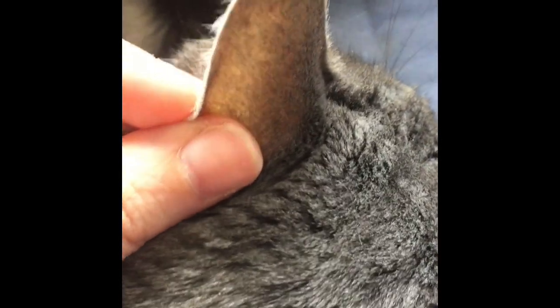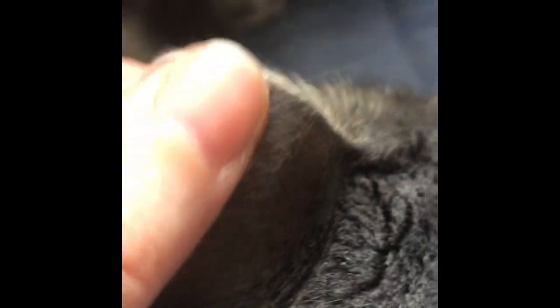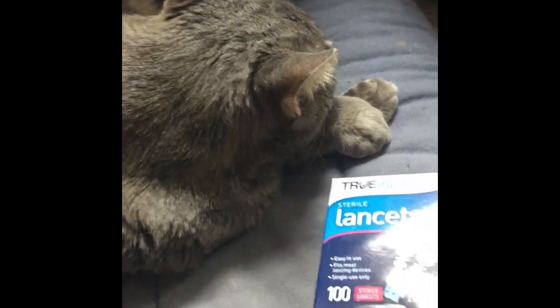So if I kind of hold it up to the light, you can see that little vein in there. You don't really need to poke that. So I'm going to show you how to do the poking too. Let me show you what else is inside my kit.